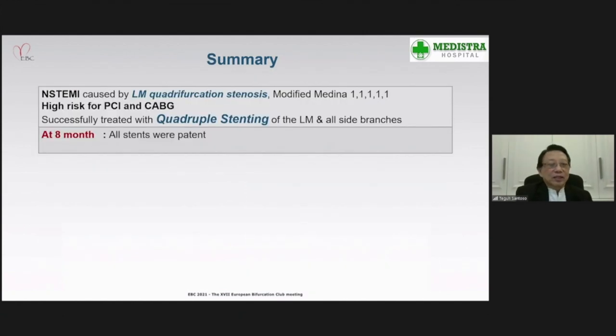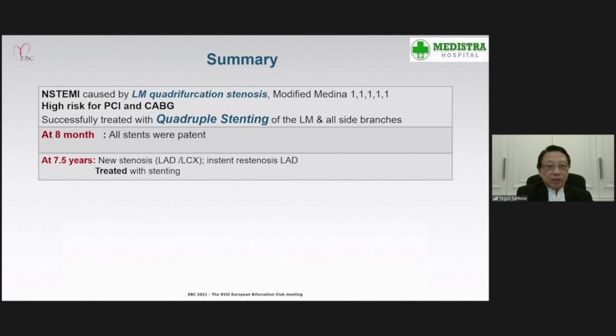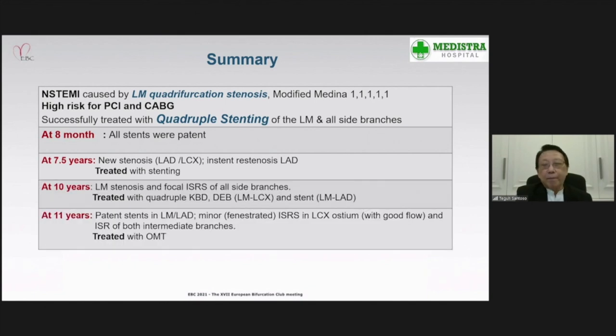Summary: this is a patient with non-STEMI caused by left main quadrifurcation stenosis, modified Medina 11111. The patient was at high risk for PCI and CABG, and was successfully treated with quadruple stenting of the left main and all side branches. At 8 months, all stents were patent. At 7.5 years, there was new stenosis in the LAD and LCX and in-stent stenosis in the LAD, treated with stenting. At 10 years, there was left main stenosis and focal in-stent restenosis of all side branches, treated with quadruple kissing balloon dilatation, DEB in the left main and LCX, and stent from the left main to LAD.